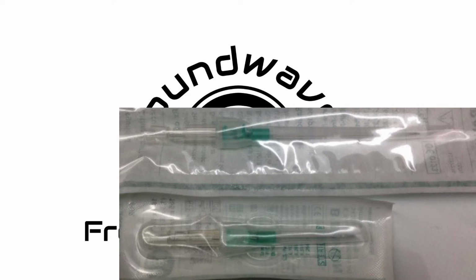And again, get the longest catheter you can get. If you can get a 1 3/4 inch or a 2 1/4 inch, 2.5 inch IV catheter, it just makes it so much better. So once you get that needle in there, you can really thread that catheter and it doesn't pull out as soon as the patient's redundant tissue moves out of the way.